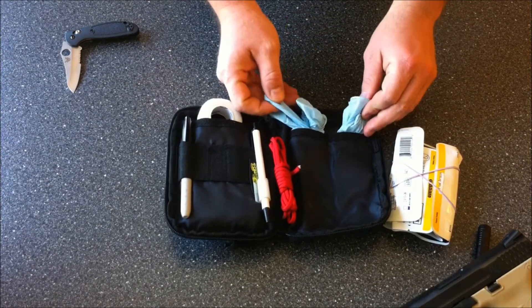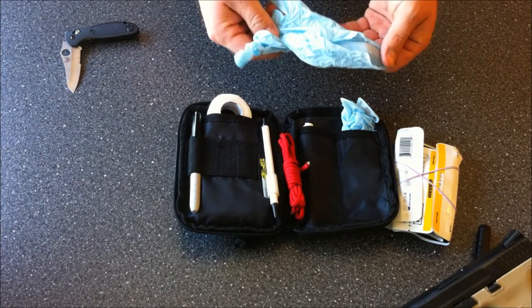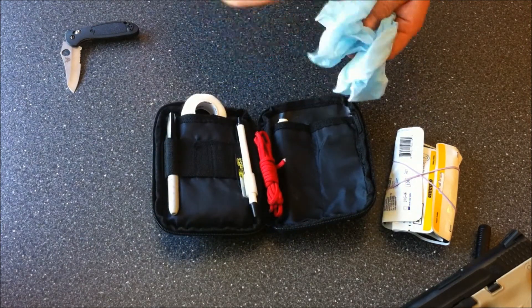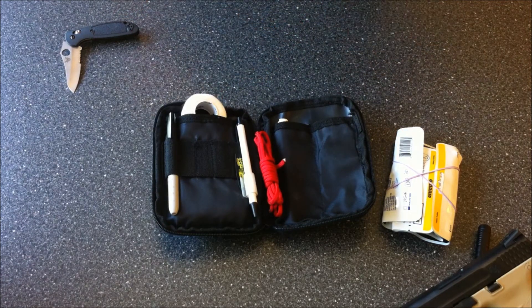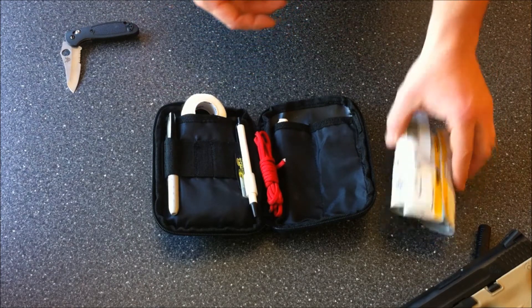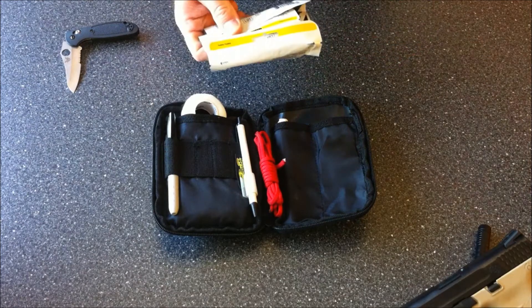First thing we'll look at is latex gloves or nitrile gloves, whatever you prefer. I have a couple sets in here. That way you can put on two sets at the same time, which allows you to change gloves out — if you dirty your hands and need a clean hand, you just take a glove off.